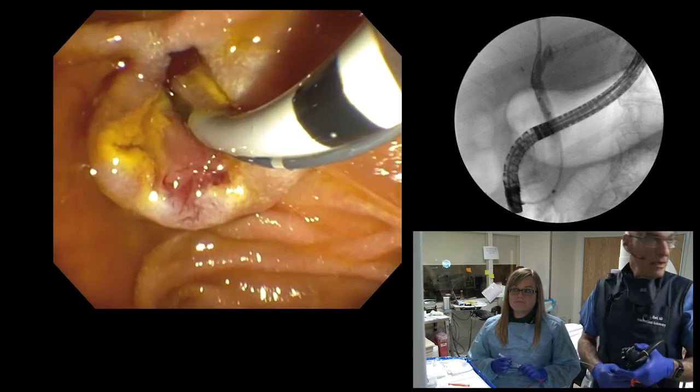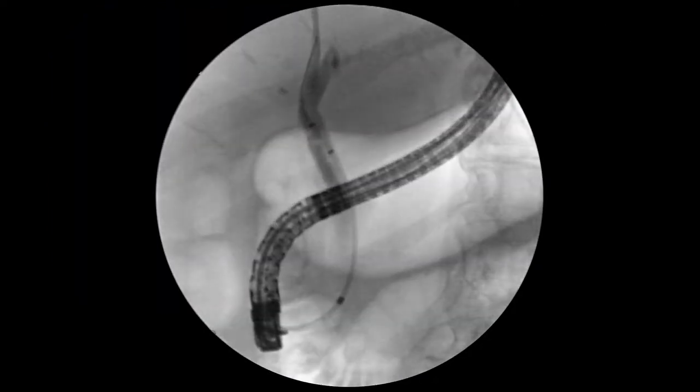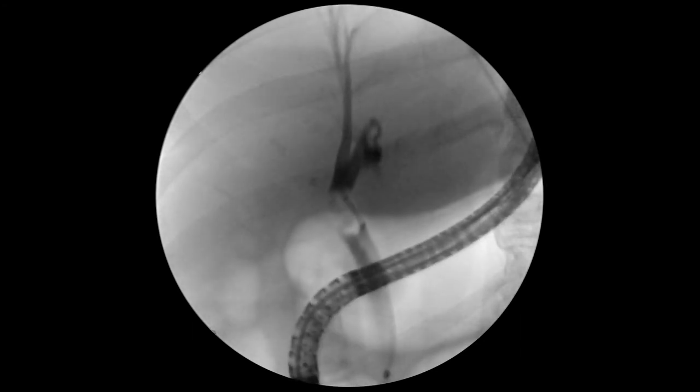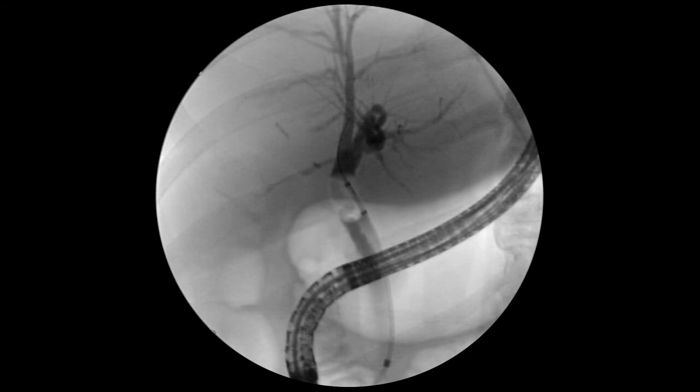I think we'll do one more sweep and then we'll be done. I always want to make sure that the intrahepatic ducts look good, that there's not something like PSC or something else. So I'm going to ask you to come up to the right side, right upper quadrant — inflate. We're going to get an intrahepatic cholangiogram here. Inject. We're filling out the intrahepatic ducts. They look normal, but we've at least documented that. Save a sharp picture, please.